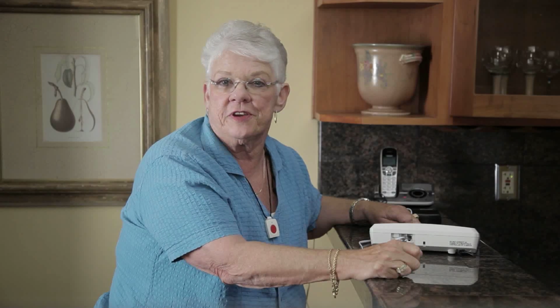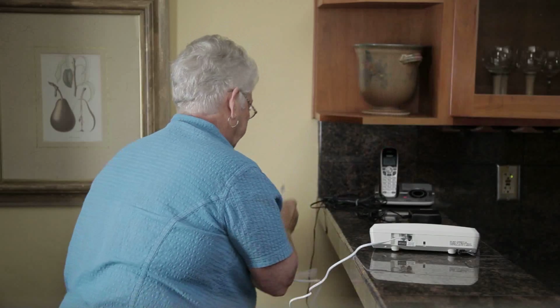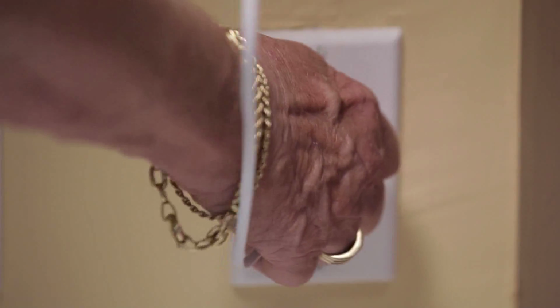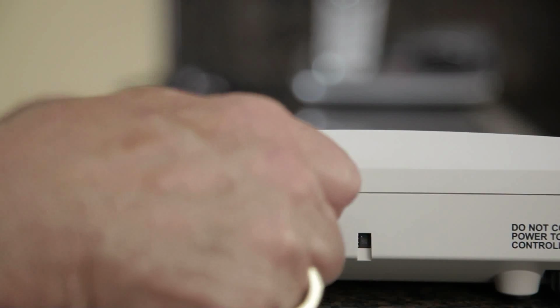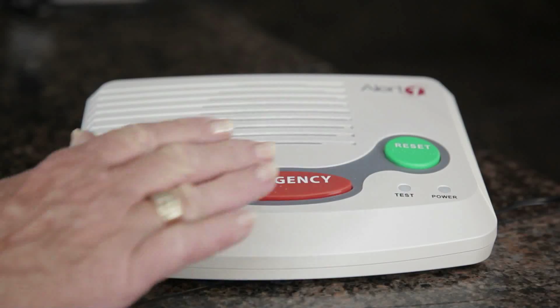Next, I plug the other end of the cord into the wall phone outlet. Now I plug my home phone cord into the other jack on the back of the unit. Well, that was easy. To test your system, just push the emergency button.